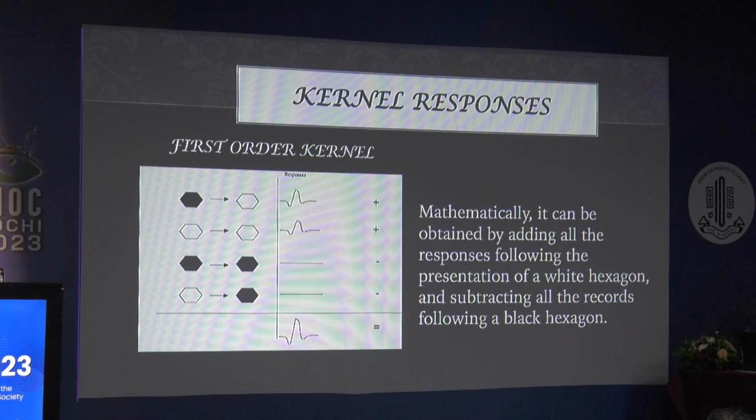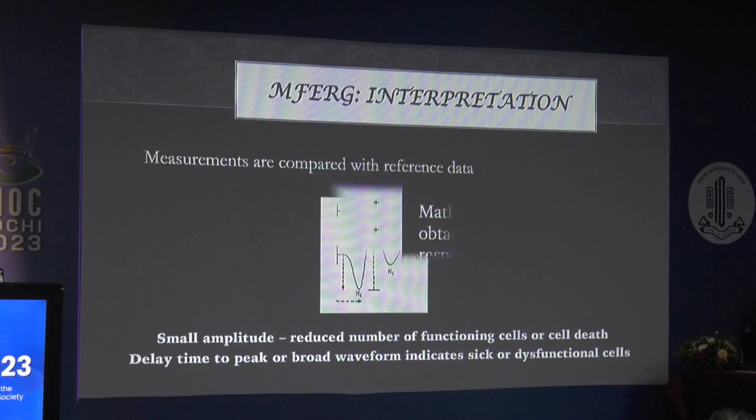It also depends whether the previous flash was bright or dark. That will affect the stimulation. So this is what is called kernel responses.